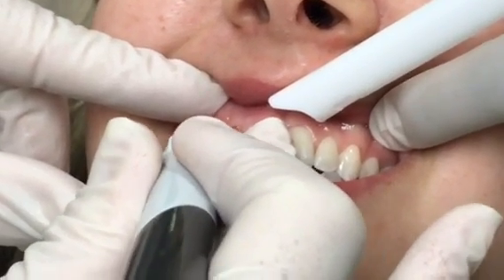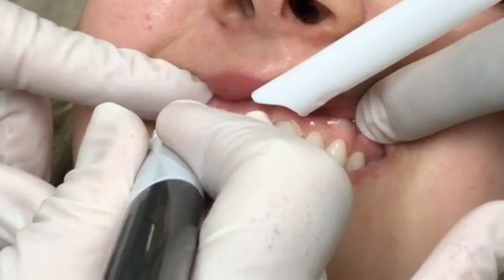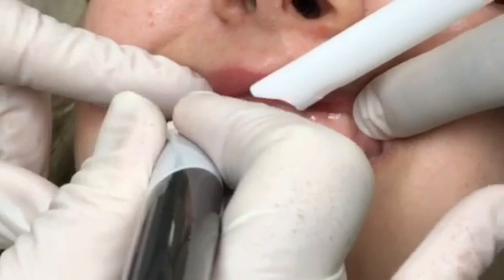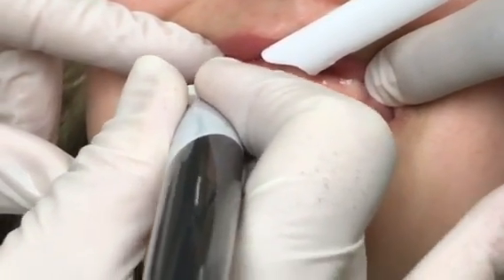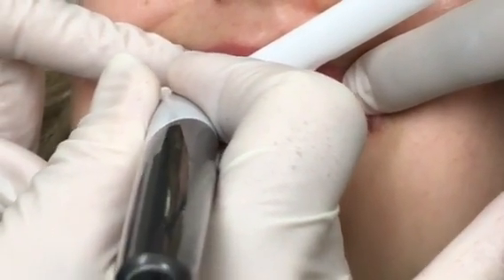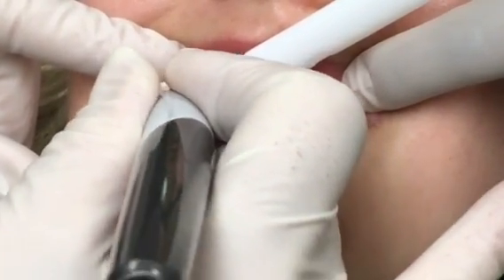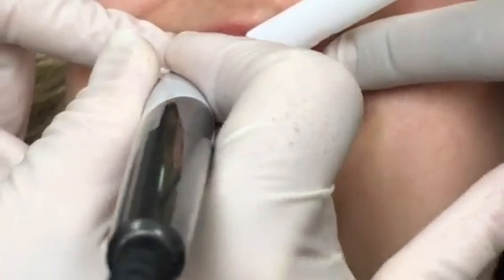So it's very easy to do. We're just rounding this off, trying to create it where it's more symmetrical with the other side. And this is going to make her tooth appear longer. And guess what? She's going to be happy.